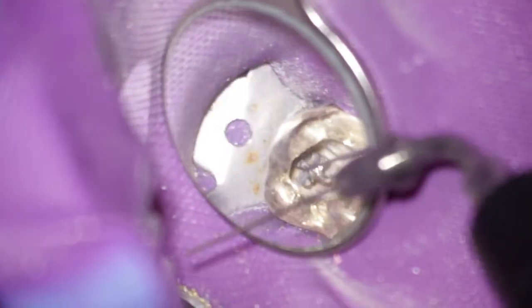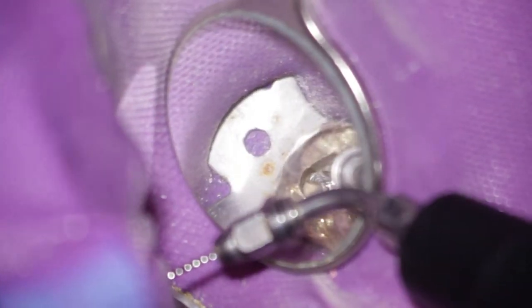You can see the power when you watch how small remnants of resin are destroyed and vibrated out of the gaps. Normally it has to be done with water cooling, because this procedure produces heat in the post and the surrounding dentine, but for demonstration I recorded the sequences without water cooling, so you have a better view.